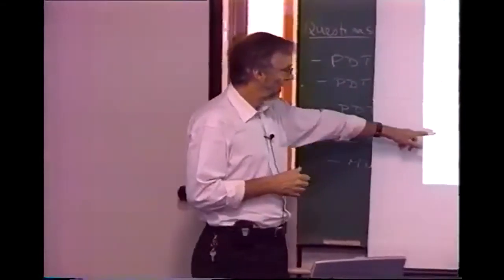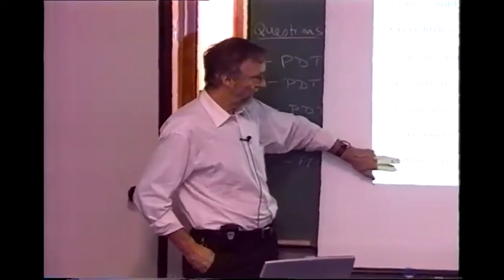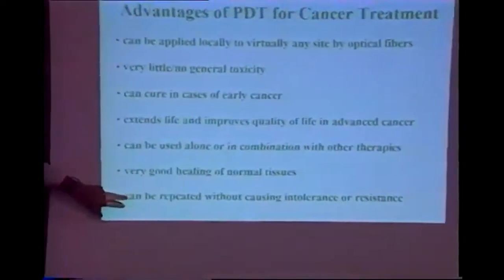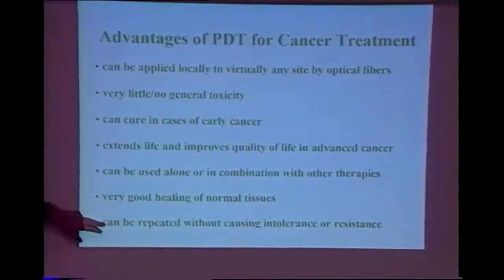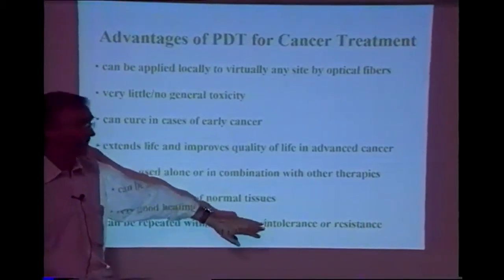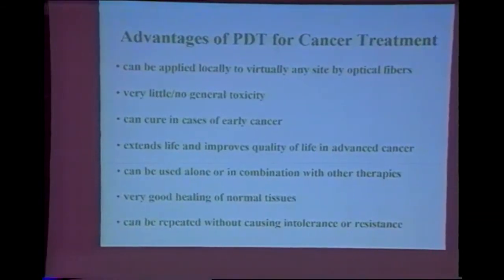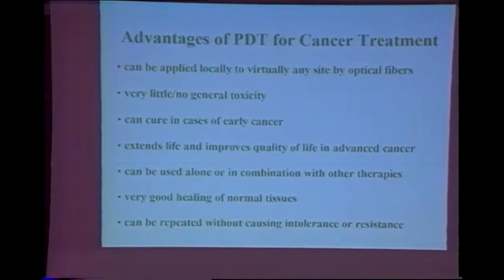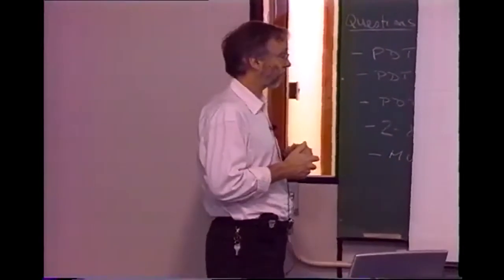There's very good healing with normal tissues, and as far as we know, and this is a big advantage, in principle PDT can be repeated many times on the same tissue without causing either intolerance of the tissue or resistance. Again, because you're not changing the DNA, so there's no genetic alteration to the cells.